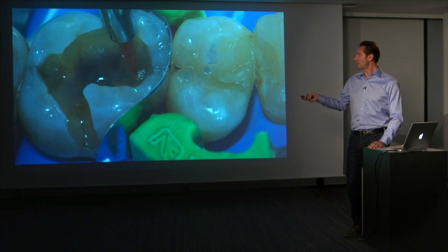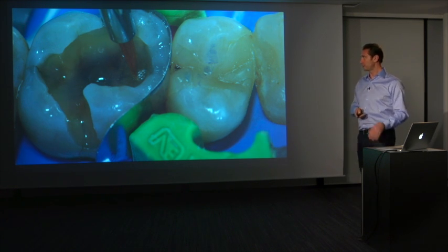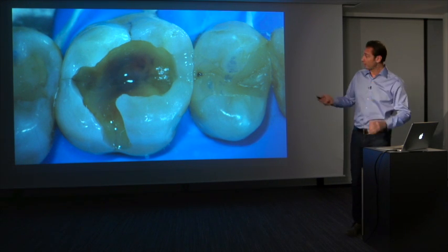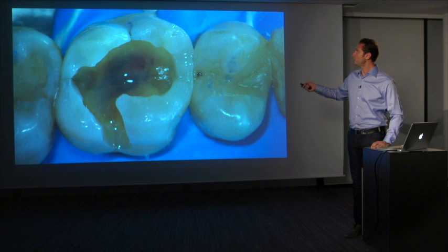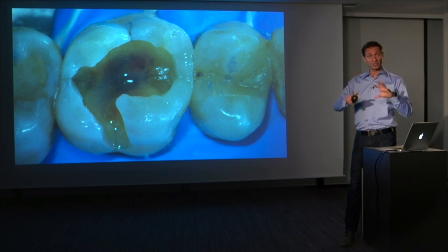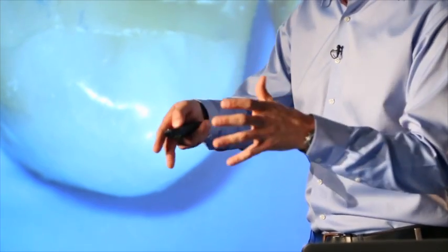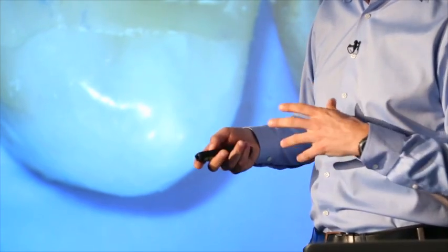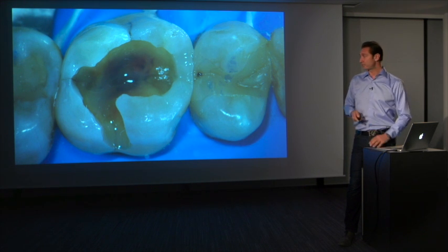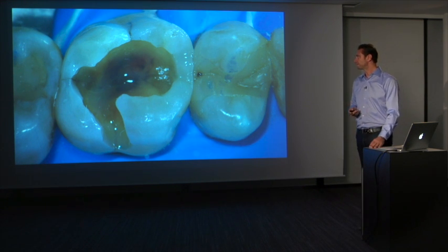So once this area is closed, you can do the buildup of the central part. What I would suggest, once the box is closed, is to remove the separation ring and the matrix, because it creates a field which is much more accessible. You will have less interference and a much easier way of creating the occlusal morphology when nothing else is hindering you.